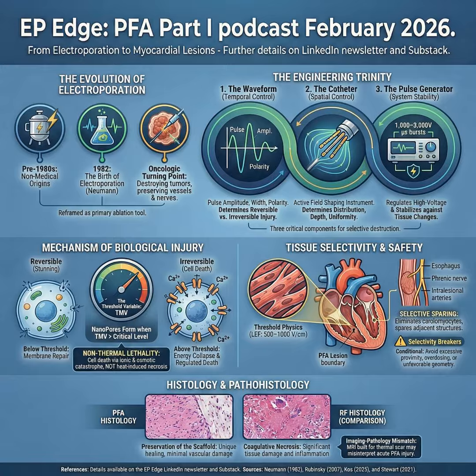Here's the roadmap for part 1, this foundational episode. We're going to cover 4 pillars. 1, the Engineering Trinity, waveform, catheter, and pulse generator. PFA is a system, not a single energy source. 2, tissue injury mechanisms, how a membrane-first injury actually leads to cell death. 3, tissue selectivity, why myocardium can be preferentially injured and why that selectivity is conditional, not absolute. And 4, histology and pathohistology, what lesions look like acutely and chronically and why imaging can mislead.